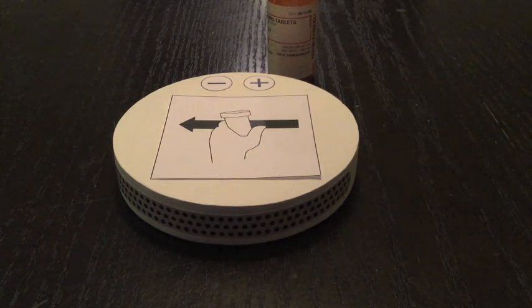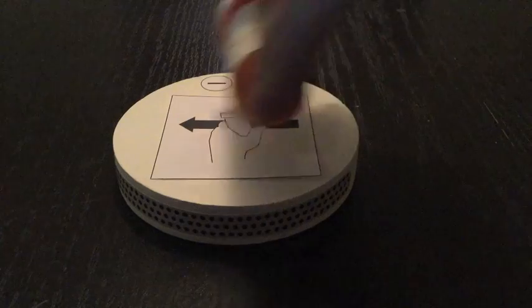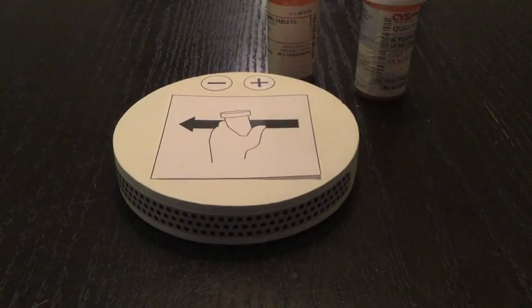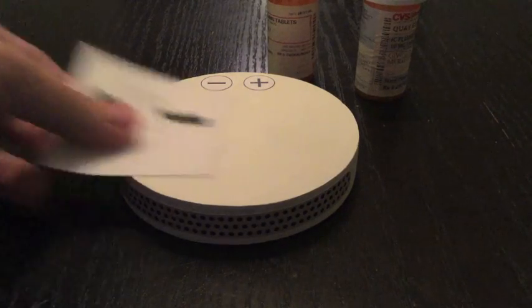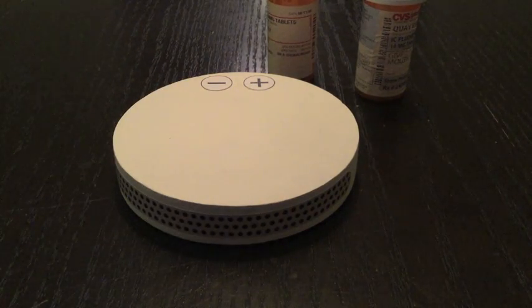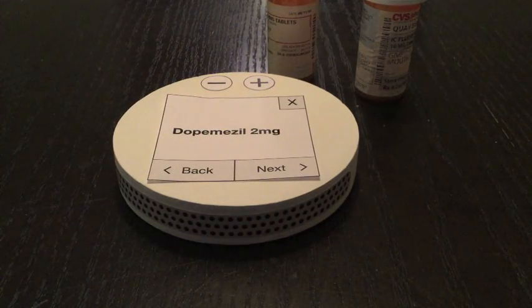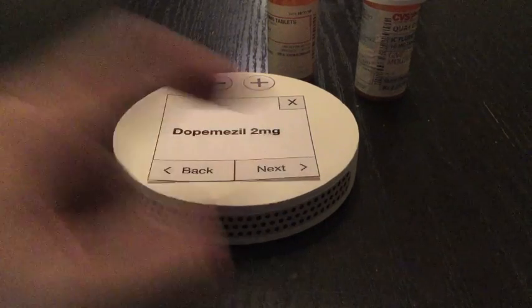The user takes the medication, passes it over the device to scan it. The medication is read by the device. By scanning the label and the barcode on the label, it reads the name of the medication and relays that back to the user for confirmation. If correct, the user clicks Next.